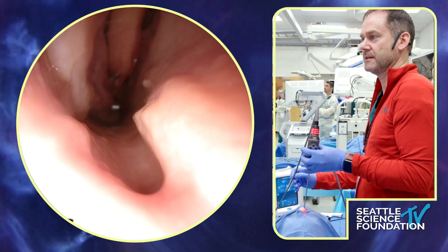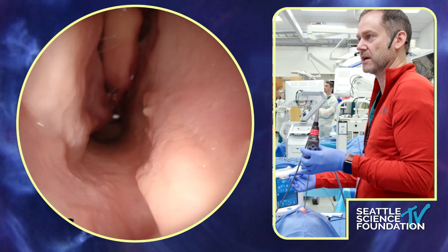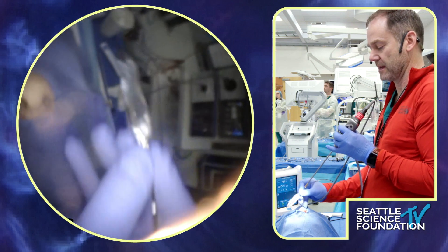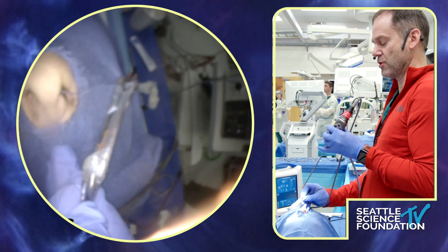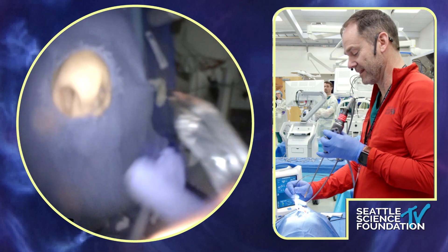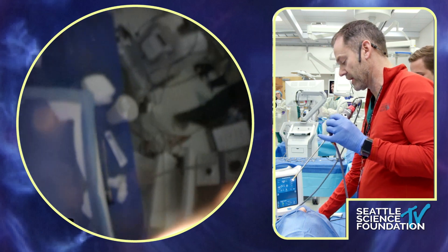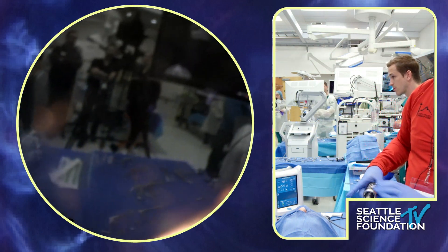It does a wonderful job out-fracturing that inferior turbinate. This is the maxillary crest — that's the mushroom of the maxillary crest — so you're not going to move that with a balloon. The next challenge is after you use it: you can see how thin the balloon is now, it's no longer that nice tight balloon, and it's hard for the next side to get it back in. You really have to work it in there.